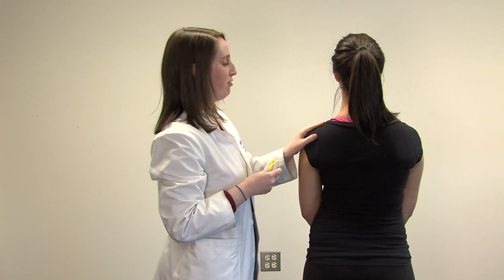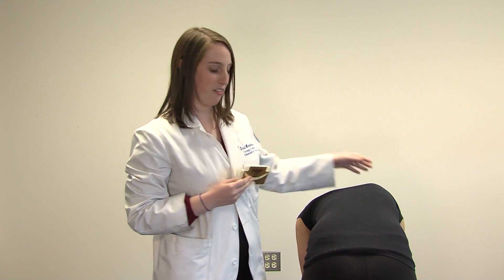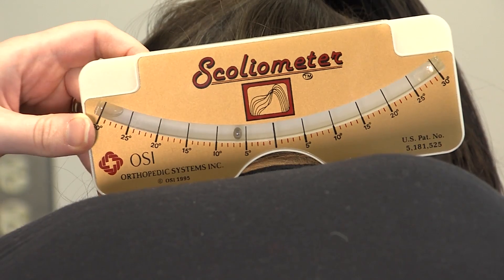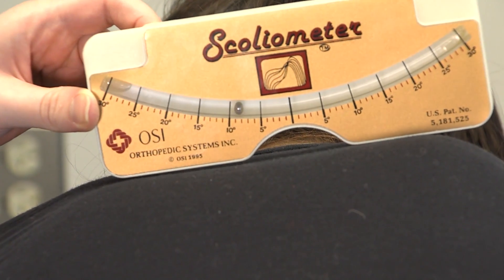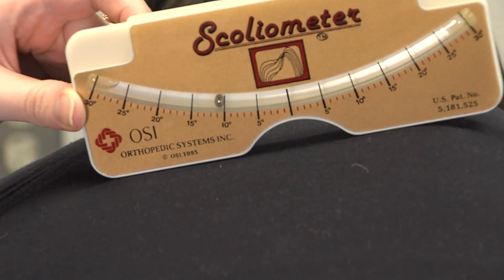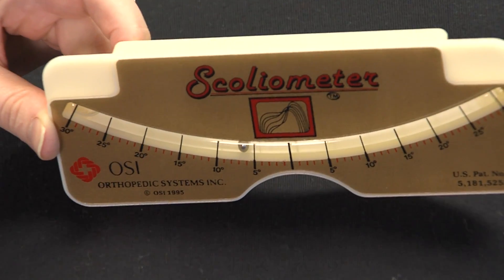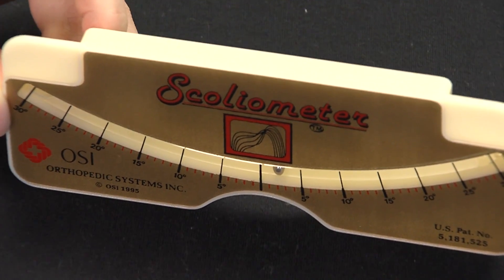I'll have the patient flex forward and here you can see the paravertebral humping already on the right side. Using the scoliometer starting at T1, slowly advance it and you can see the needle moving towards 10 degrees and now coming back the other way as the lumbar spine compensates.